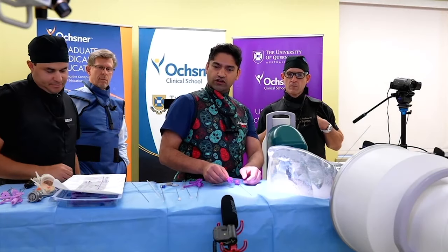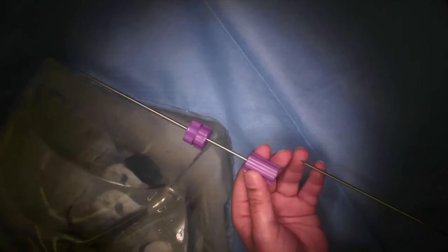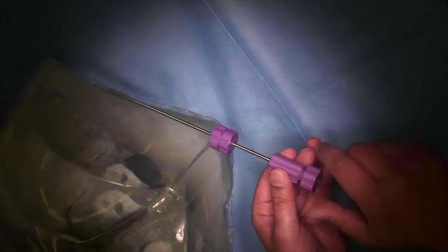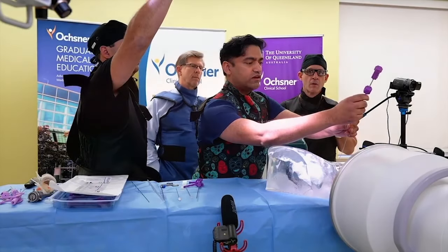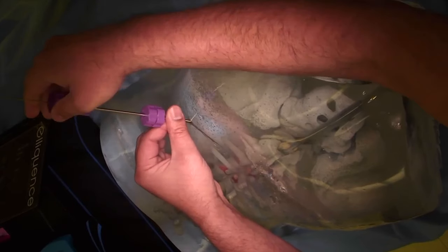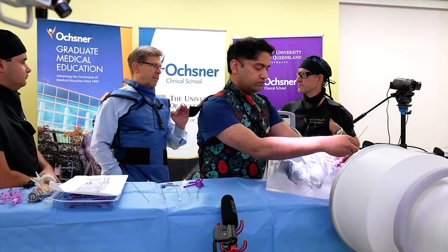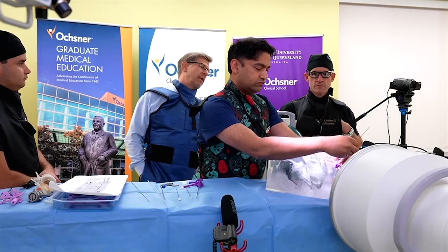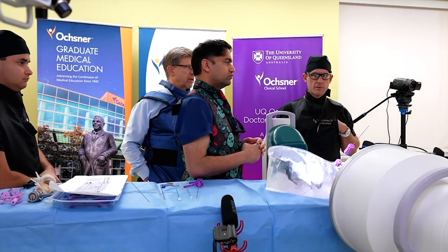We've got two tools here: our cannula and our dilator. The dilator goes into the cannula, and this whole assembly screws into place. We're going to use Seldinger's technique — place that into position, dilating a little bit to get down to the level of the disc. The cannula also has a bevel on it, marked by hash marks right on the handle, so you always know which direction the bevel is turned.